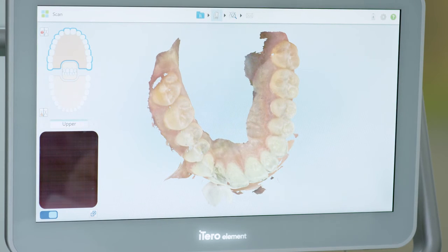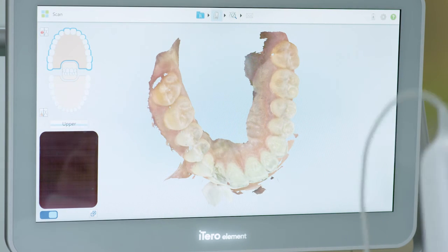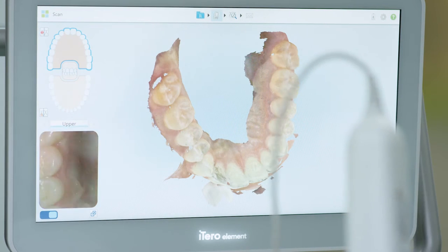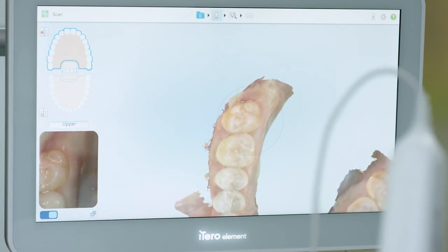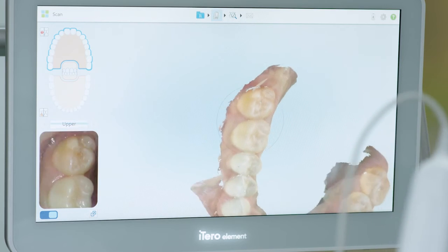If this is an Invisalign scan, confirm that all areas of missing anatomy are filled.